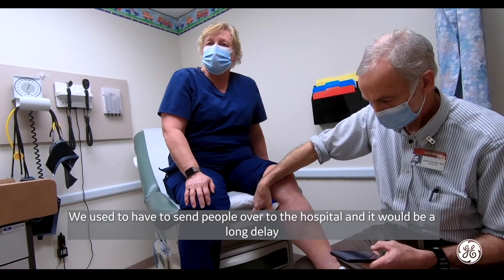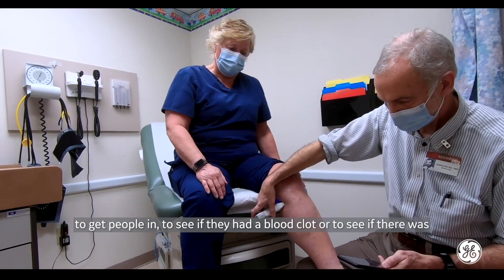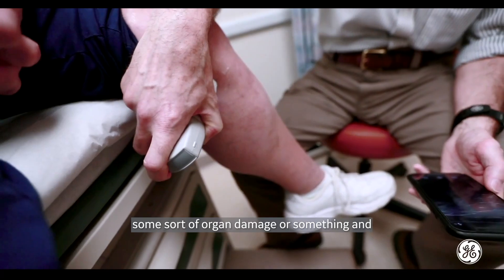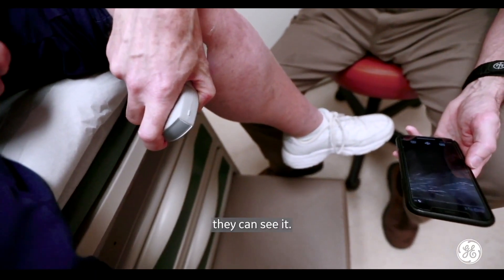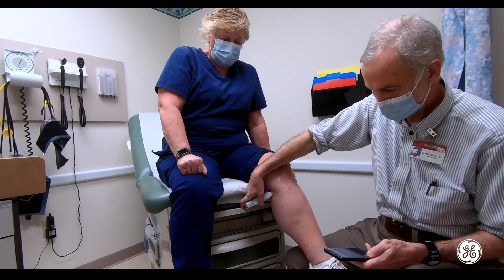I used to have to send people over to the hospital, and it would be a long delay to get people in to see if they had a blood clot or to see if there was some sort of organ damage or something — and they can see it now. It's right here in the office. That's amazing.